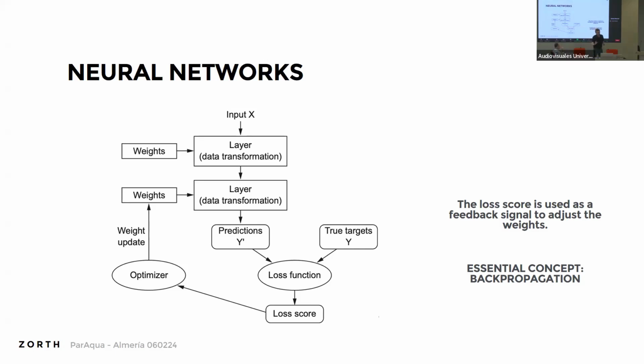One term that you will hear from people that are doing this type of AI is an epoch. What is an epoch? When you take a whole data set and you get it through this operation, when the whole data set has been looked at and you're updating the weights, you've had one epoch. And we're training basically anywhere between 15 and hundreds of epochs. The time it takes to compute an epoch gives you the time it takes to train your full network.